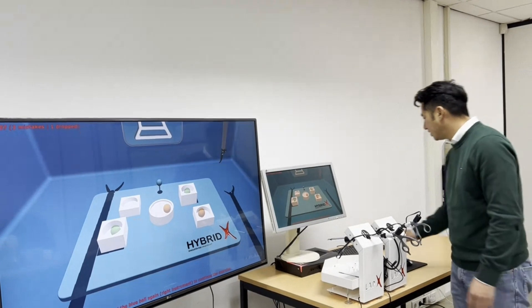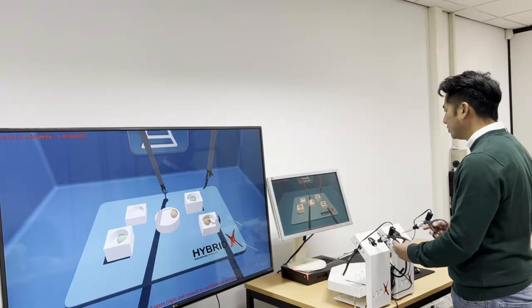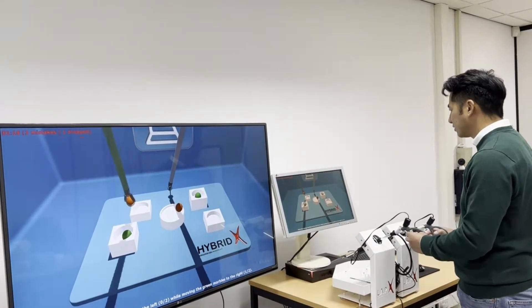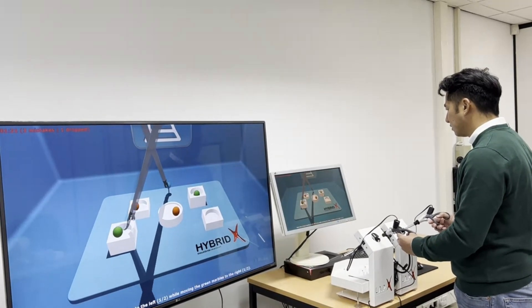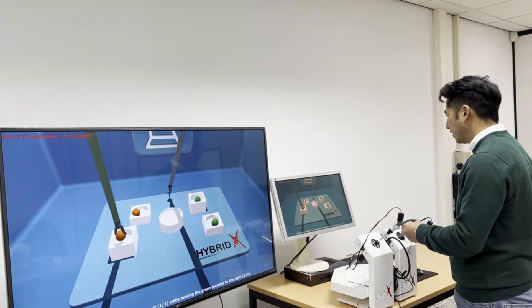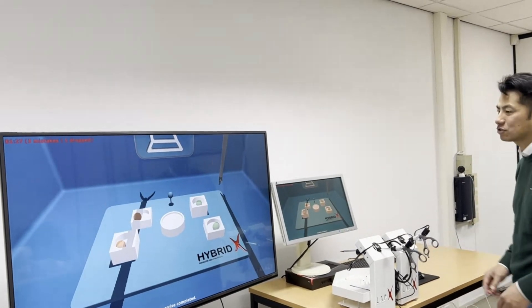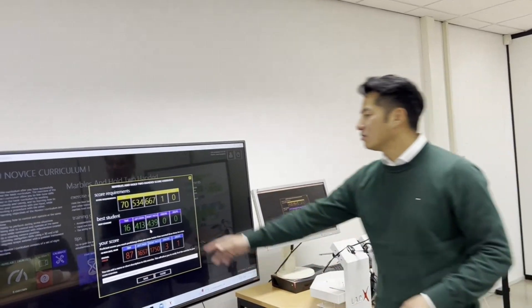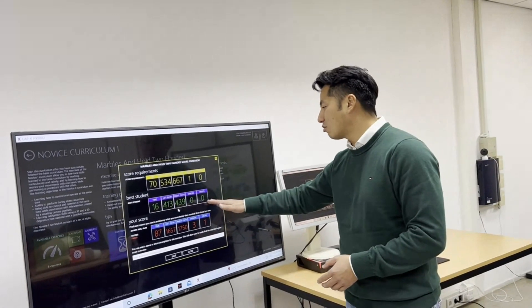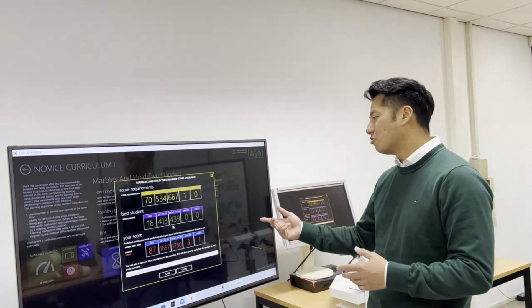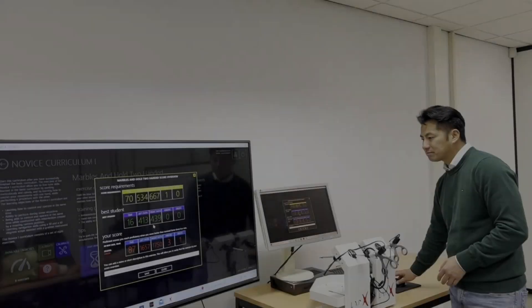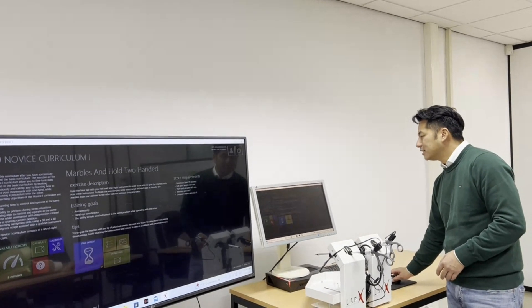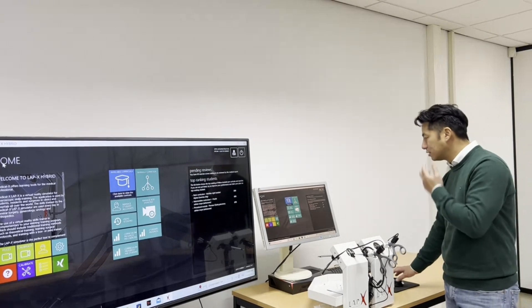So after you have finished the exercise the computer will show you the results that you have gotten from doing the exercise. So let me finish this. Move the green one there. Move the last orange marble there. Now it says exercise completed. And the computer will show you the results of your exercise. So here you can see the nominal score that you have to score. This is the best student score. So even if you have passed but you're quite competitive, you know who the best student was and then you can train again to be the best yourself.